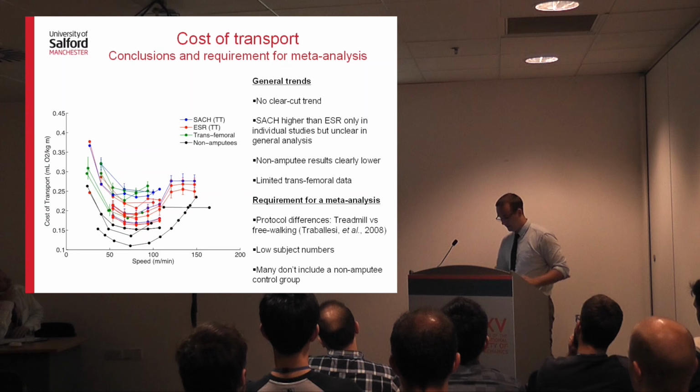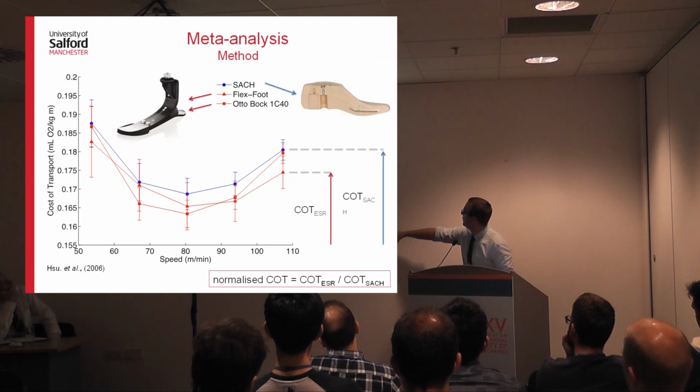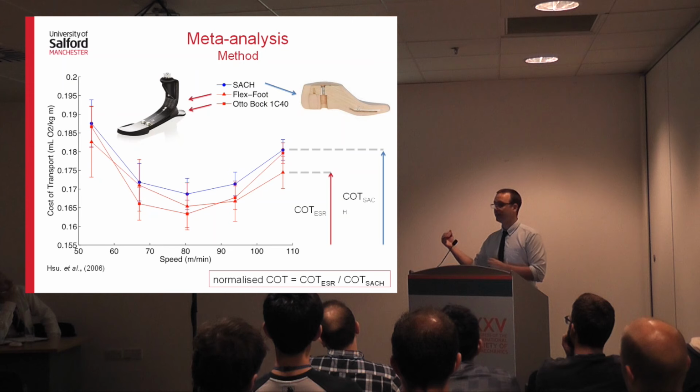Okay, so what did we do? How did we get around this problem of the data being such a mess? So what we did is we took, there should be an arrow here, unfortunately, you can't quite see it because it's a black bar, but we took the cost of transport with an ESR foot and we divided it by the cost of transport with a SACH foot at every speed in every study.